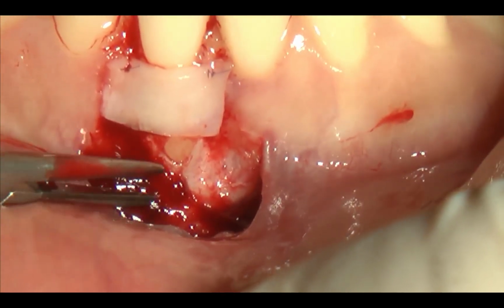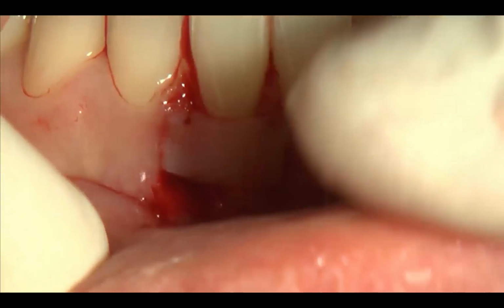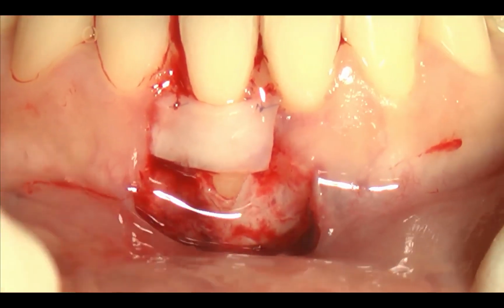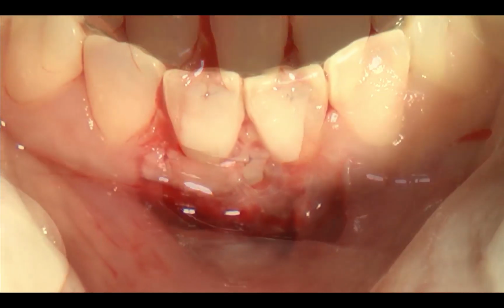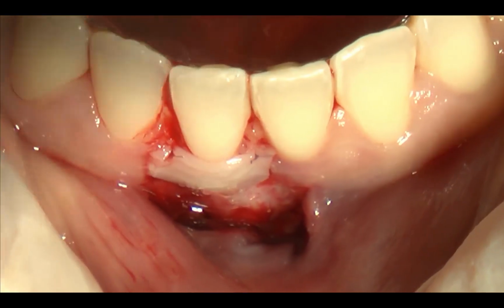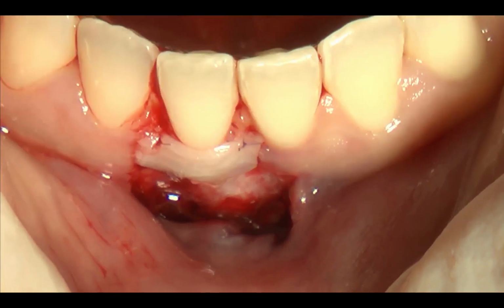I want to show you that there is some root that is exposed apically, and this does not influence at all the healing process. The graft is applied at the level of the cementoenamel junction, at the level of the root with respect to the papilla, where we don't have to interfere at all with the healing process of the surgical and anatomic papilla.